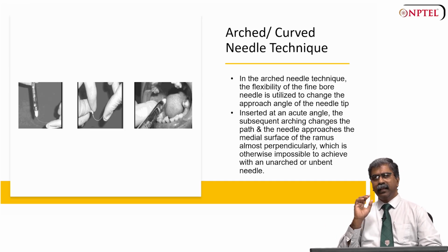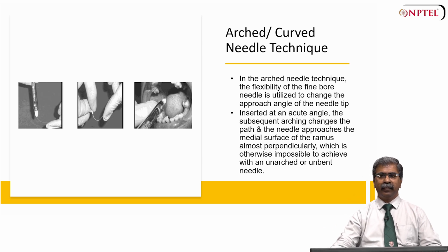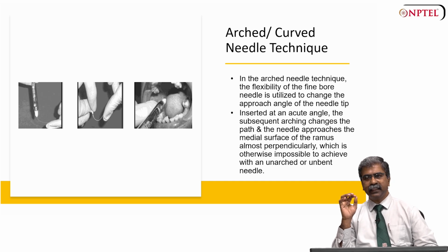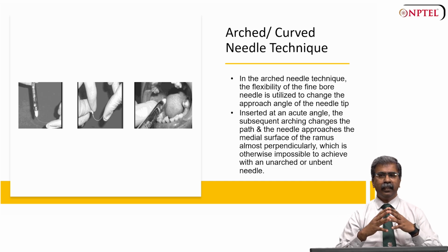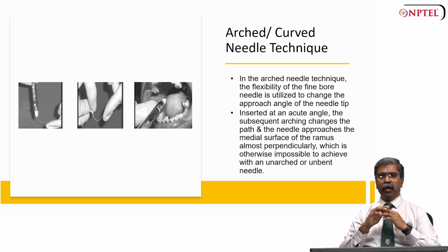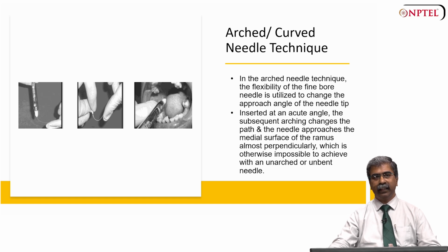Again, for completion's sake, there is another technique, the arched or curved needle technique. The advantage of this technique is that it enables clinicians to reach areas that would be difficult or impossible to access with a straight or unbent needle, improving accuracy and success rates for nerve blocks. The arched needle technique enhances the overall efficiency of dental anesthesia, particularly in challenging cases involving the mandibular region. But when you use this technique, you have to be careful to avoid needle breakage. It can happen at the hub.